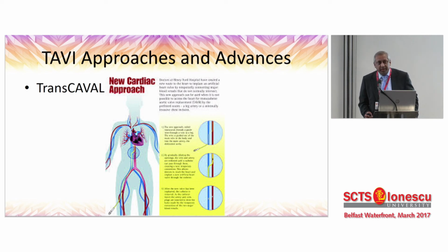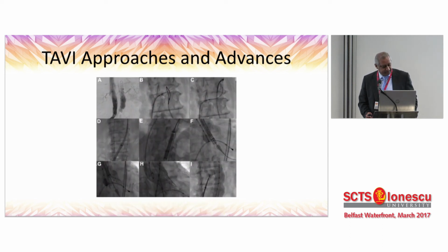How popular it will become, I'm not too sure, given that most of the TAVI devices now have become quite small in terms of their delivery size. But there may be a place for these where you do have some patients with quite severe lower peripheral vascular problems, and probably just the abdominal or higher aorta is accessible for a good access to deliver the device.